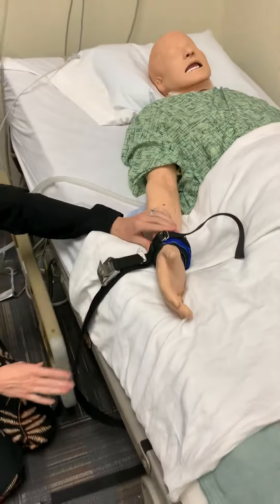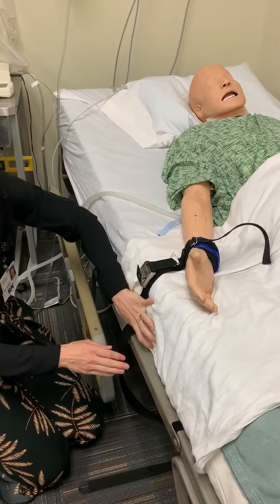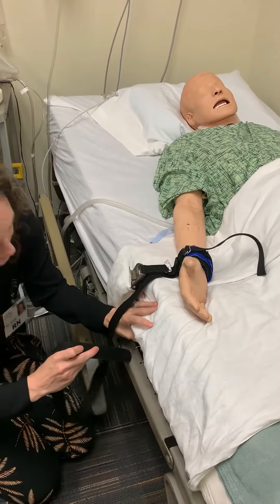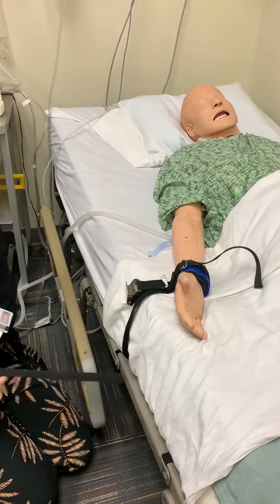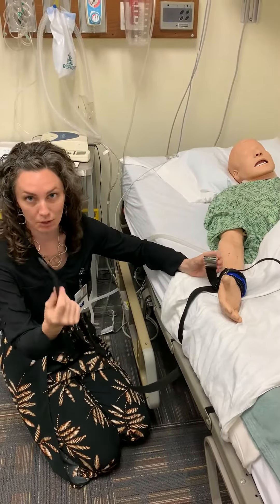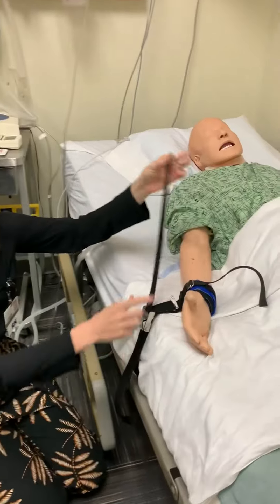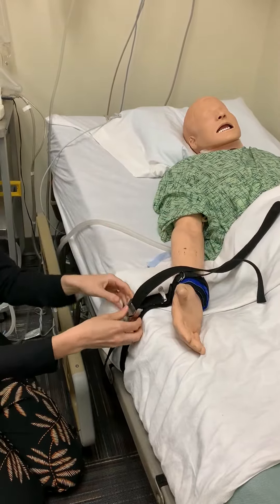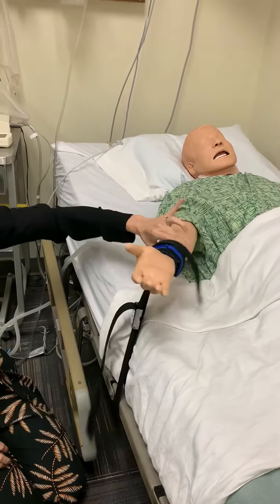To attach this to the bed, you want to use a non-movable part. For this bed, we'll just use this frame. This just slides around the frame like this. It's very similar to an amusement park seatbelt — it just slides through here. Adjust it as tight or as loose as you need it, then snap it. Now your patient's attached.